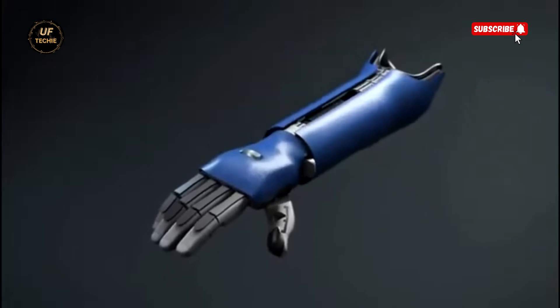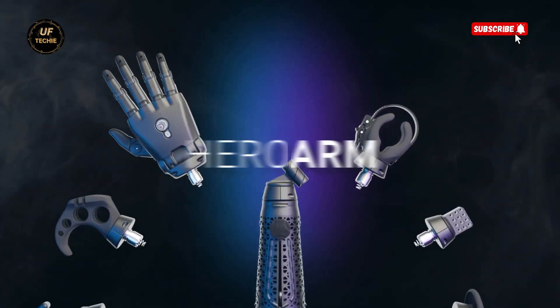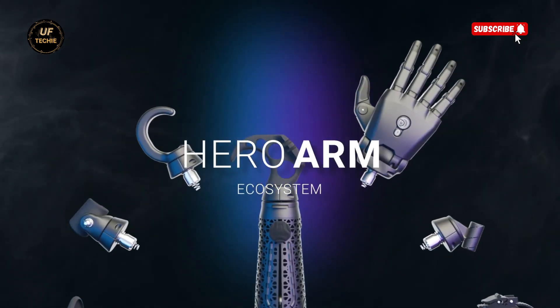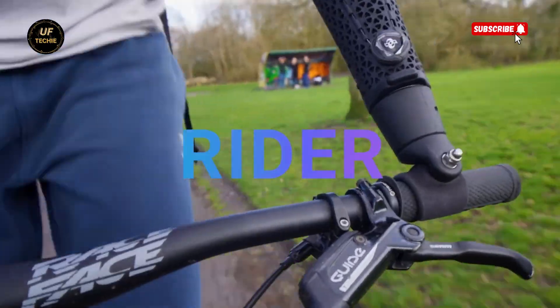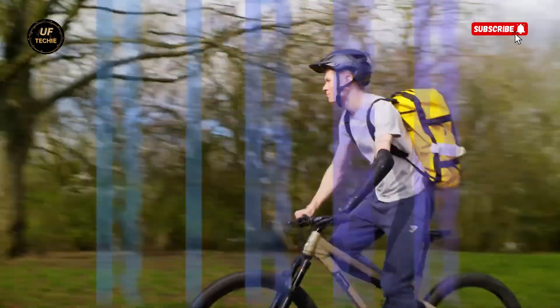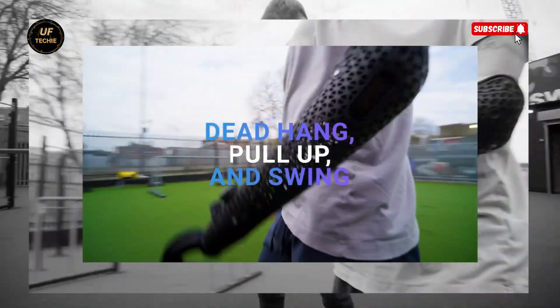But it's not just about function. The Hero Arm is designed to make users feel proud and powerful. It features swappable magnetic covers that can be customized to match your personality — whether it's a sleek black matte finish, bold metallics, or themed designs from Marvel, Star Wars, or Disney. The Hero Arm looks like something straight out of a sci-fi film.